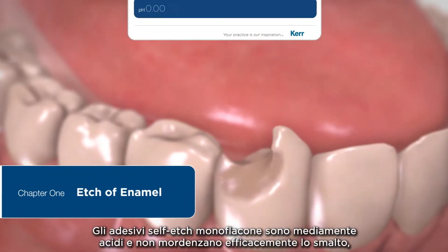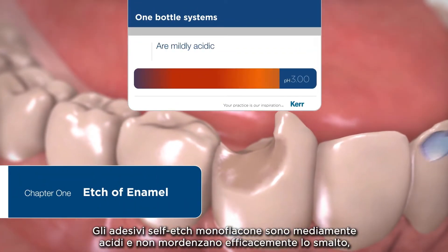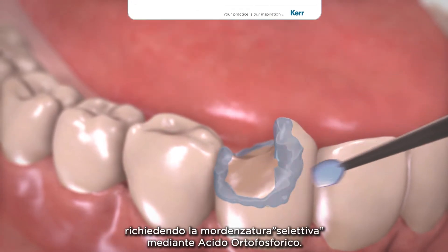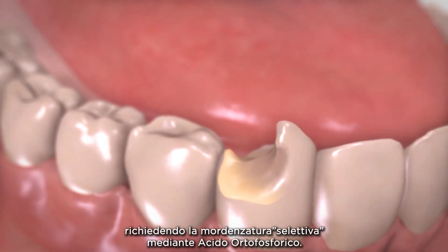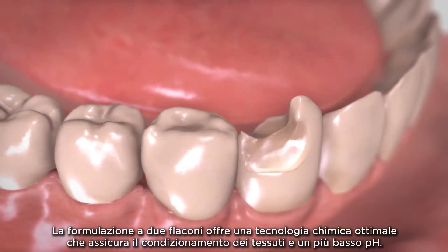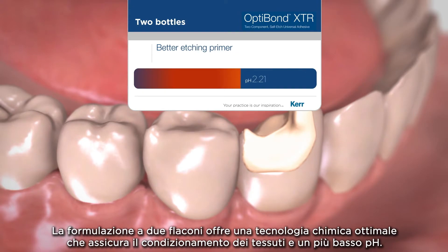One bottle self-etch bonding agents are mildly acidic and do not effectively etch the enamel, requiring selective etching using phosphoric acid. Two bottles provide optimum chemistry allowing for a better etching primer and lower pH.